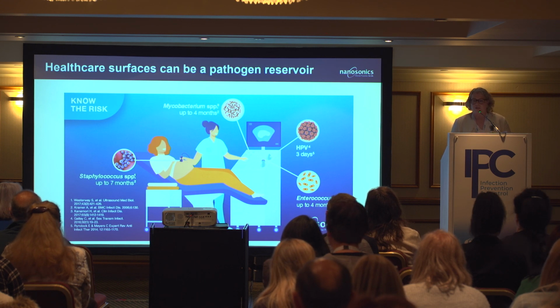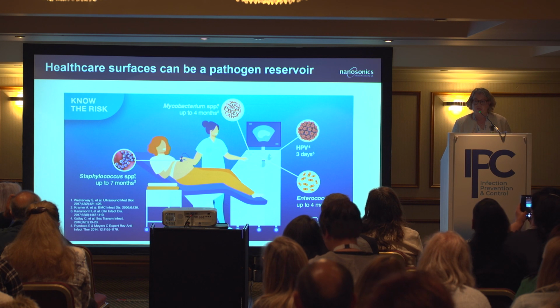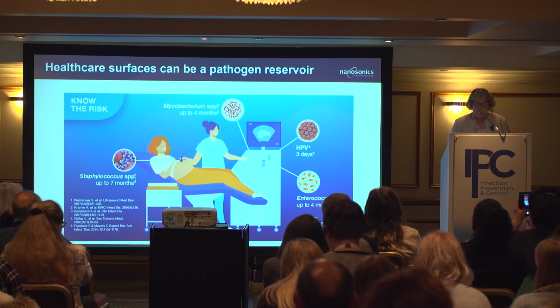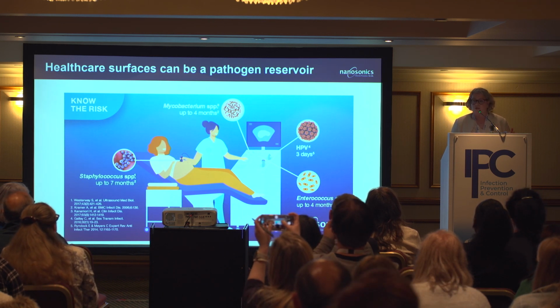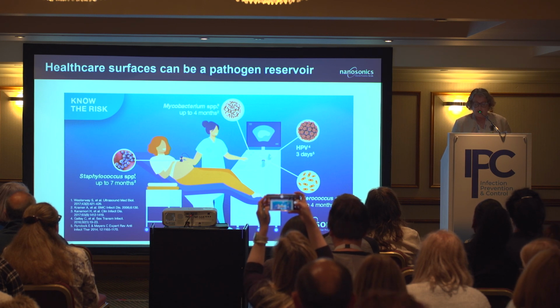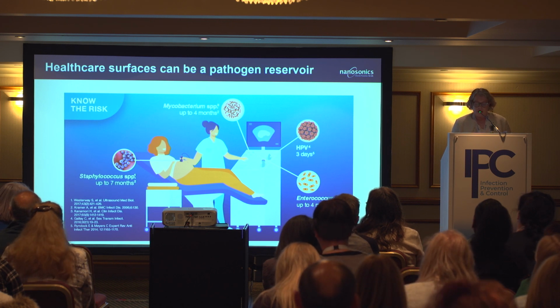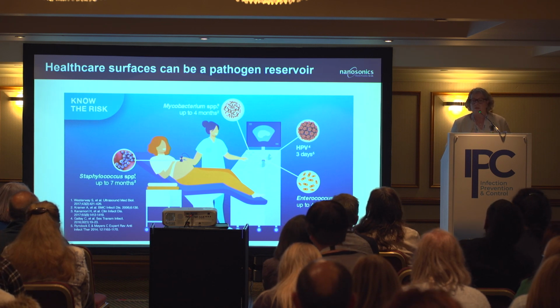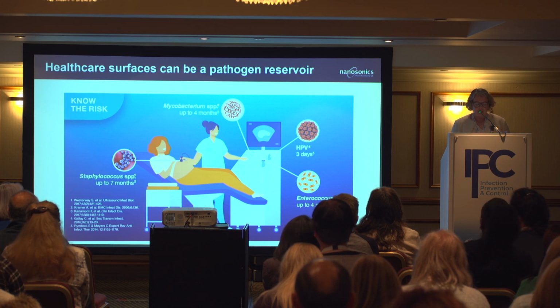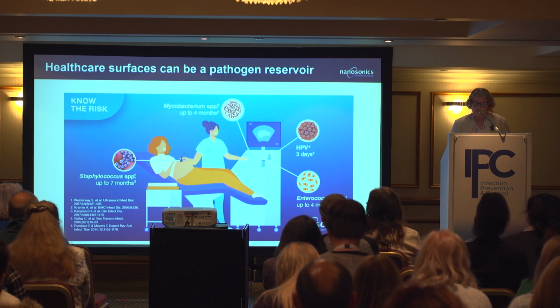So we know in healthcare the surfaces and the environment around the patients can be a pathogen reservoir. But what's surprising sometimes is to understand how long some of these pathogens remain in the environment. And so looking at these pathogens that persist on surfaces for several months, studies have shown that the healthcare environment, as well as the ultrasound environment, is a pathogen reservoir. And so looking at how these medical devices and the surfaces around the patient are then disinfected to ensure that you are killing pathogens and, most importantly, preventing cross-transmission from patient to patient. So essentially looking at how these surfaces are then disinfected to help prevent healthcare-associated infections.